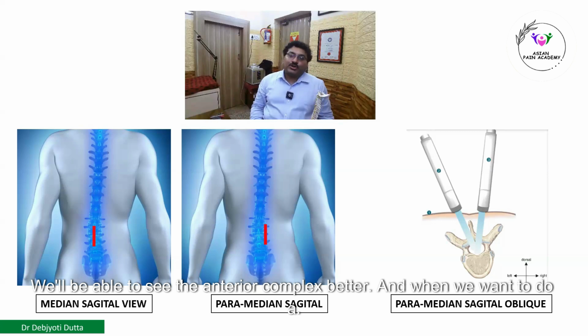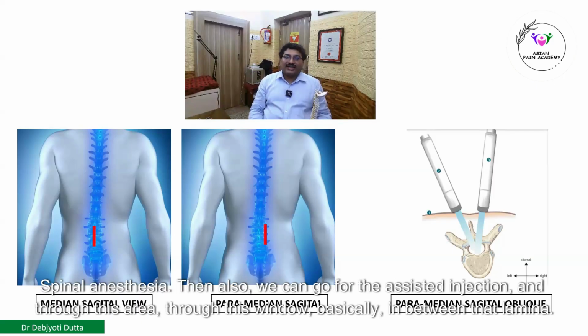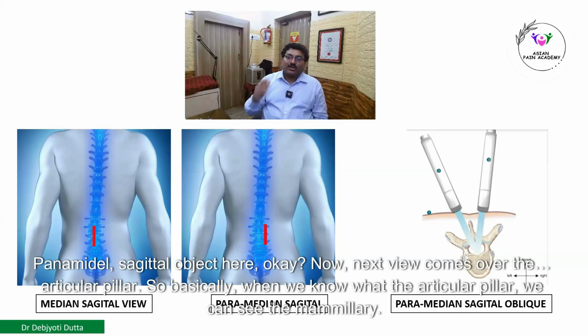And when we want to do an assisted spinal, there might be a patient where you are not able to find a space and you are not able to put the spinal anesthesia, then also we can go for the assisted injection through this window, basically in between the lamina. So this is a good way, and that is known as the paramedian sagittal oblique view.